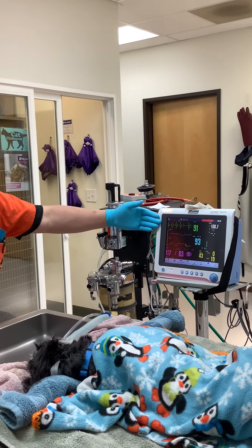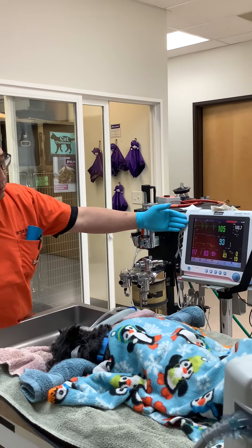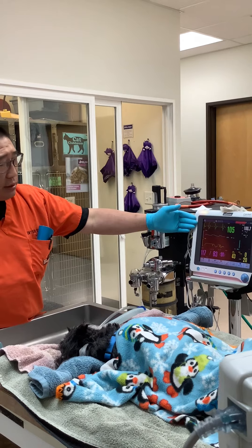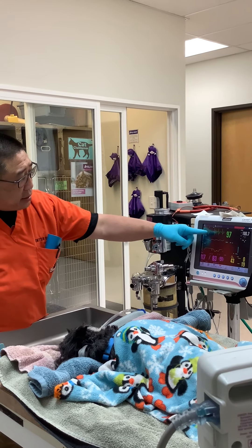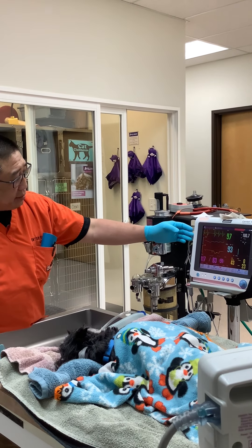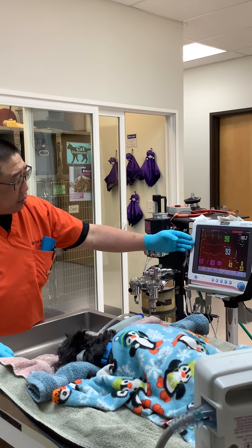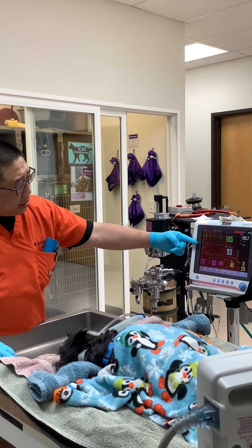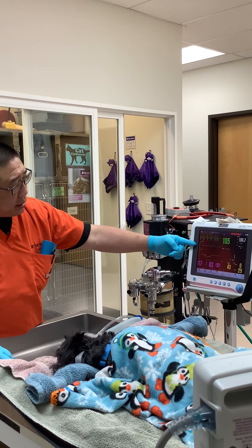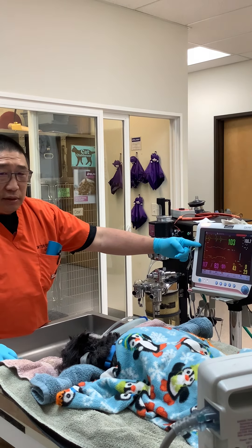We have the EKG monitor here that gives us the tracing of his heart. Right now we have a nice normal sinus rhythm — that's terrific, good job!